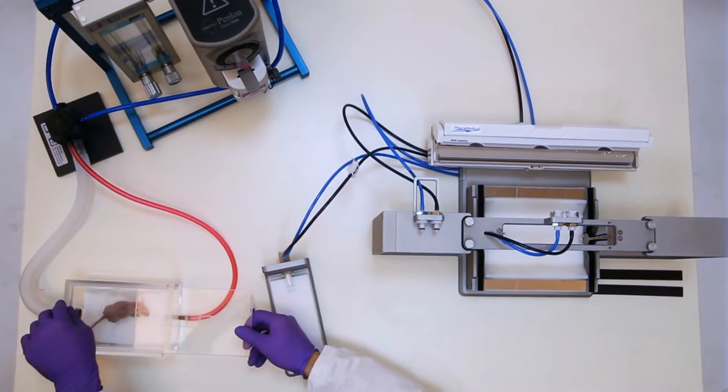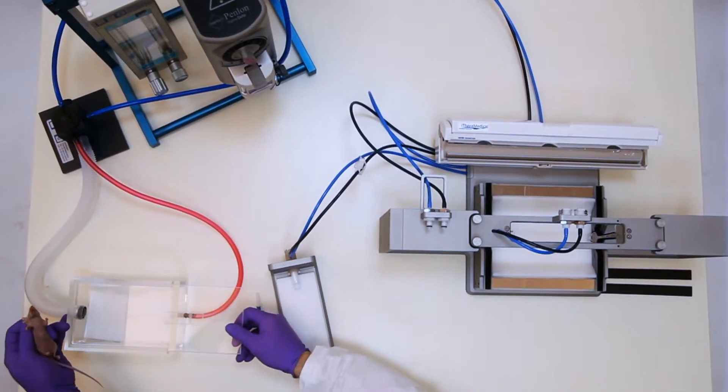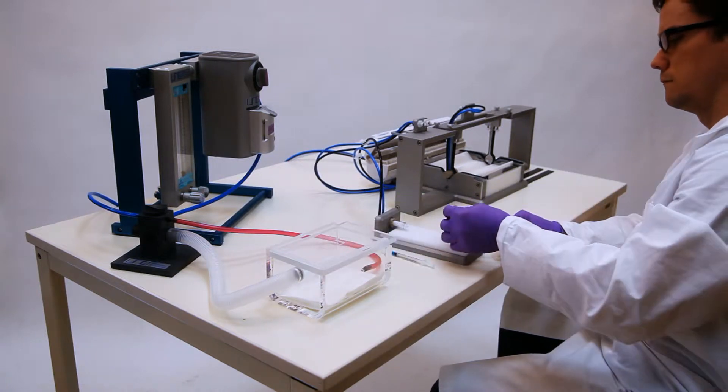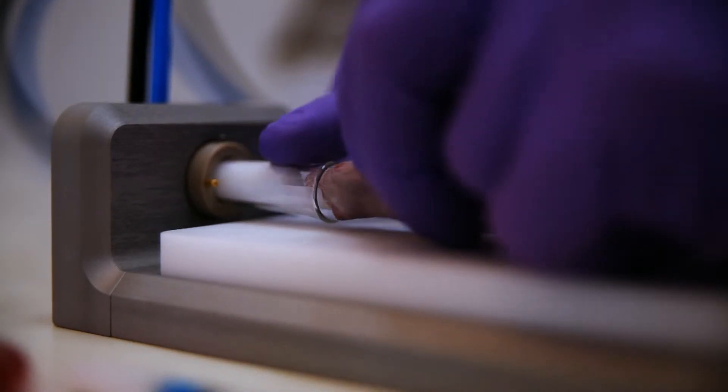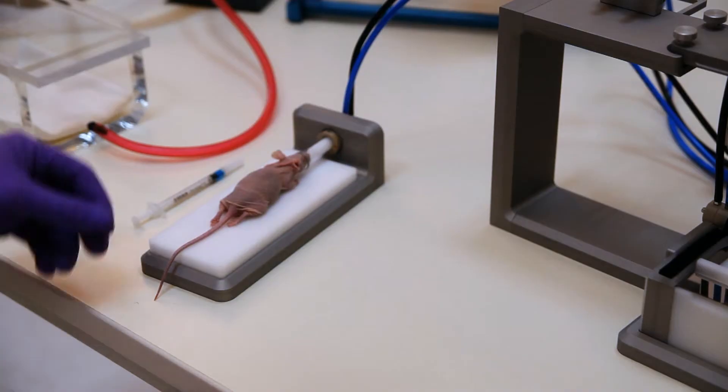Once the animal is anesthetized, it is transferred to a platform where an injection can be performed. Meanwhile, the animal is supplied with anesthesia and oxygen.